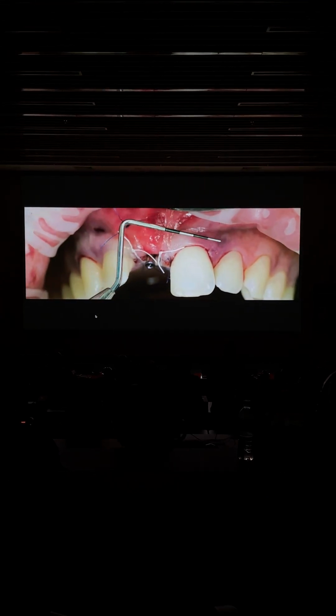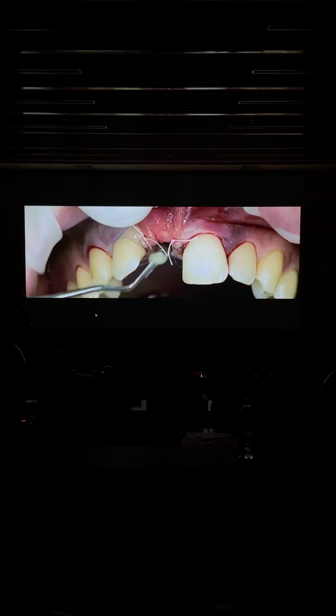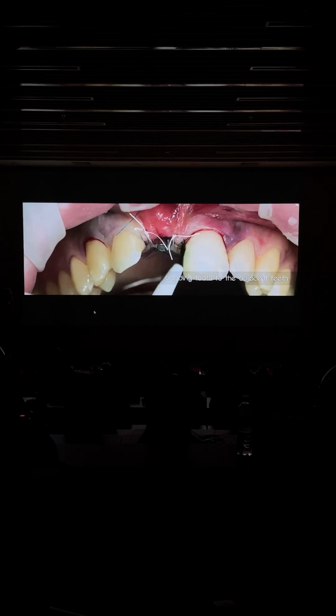Usually I use biologic agents like amelogenin, which is Emdogain, and this is injected when everything is being sutured.